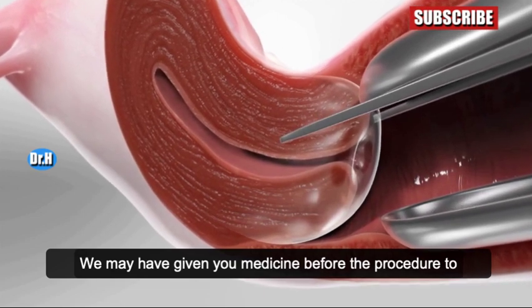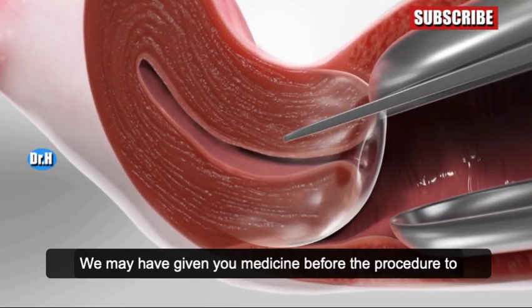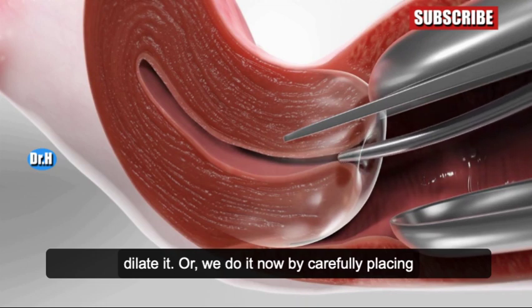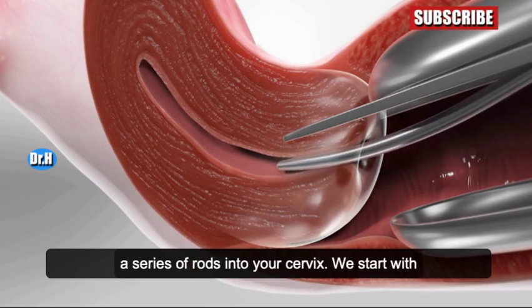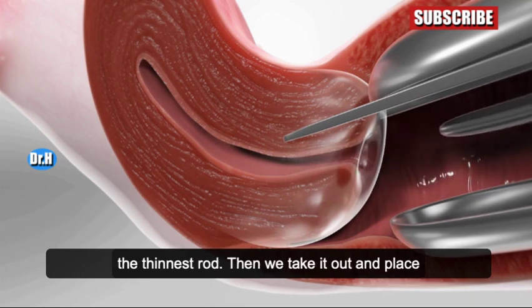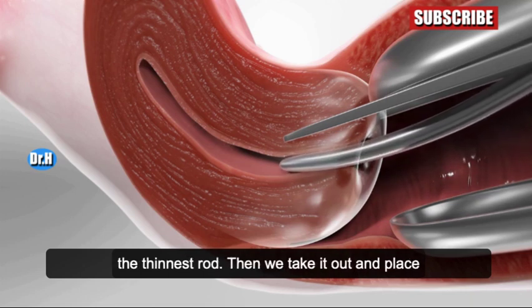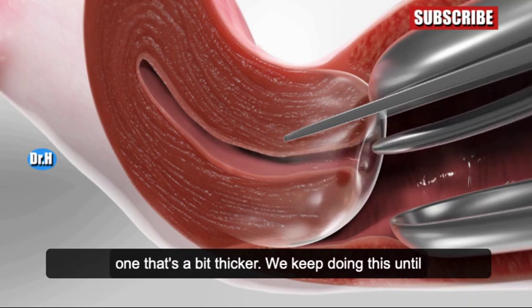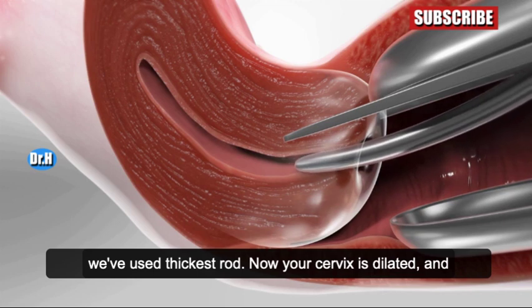We may have given you medicine before the procedure to dilate it, or we do it now by carefully placing a series of rods into your cervix. We start with the thinnest rod, then take it out and place one that's a bit thicker. We keep doing this until we have used the thickest rod. Now your cervix is dilated and we can reach your womb.